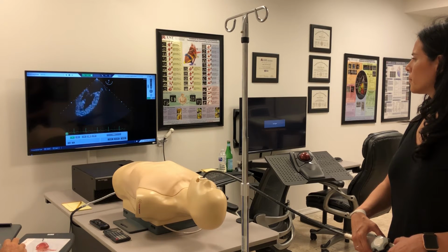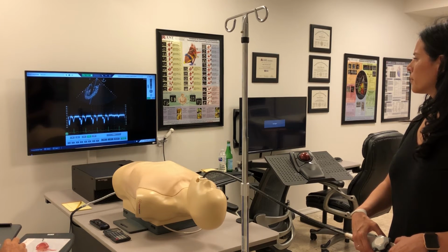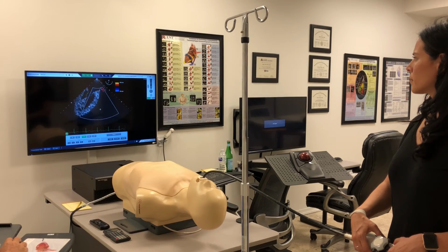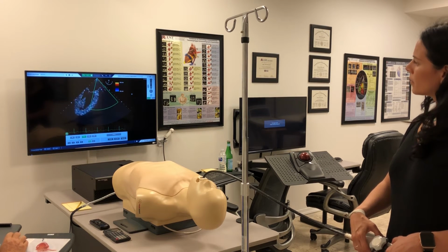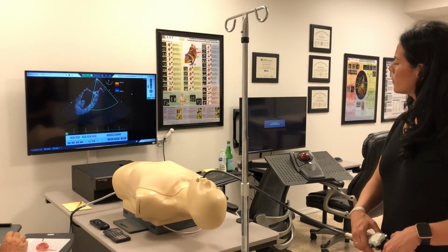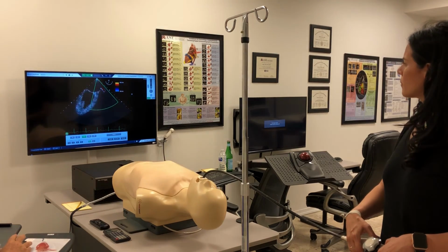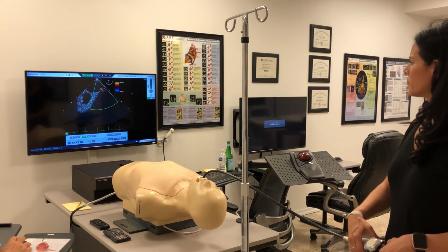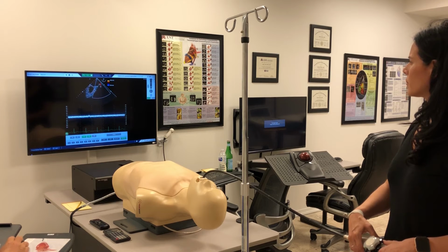And let me just show you the color pattern of the left upper pulmonary vein. I'll put a little bit of color on it. Let me turn off the PW here for a second and drag the color across it. It has a very characteristic color pattern. It's red, red, light blue, red, red, light blue. The two reds are the S and the D wave, and the light blue is the AR wave. Just as long as we're here, let me just PW that to show it to you.